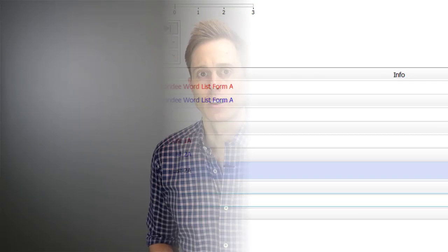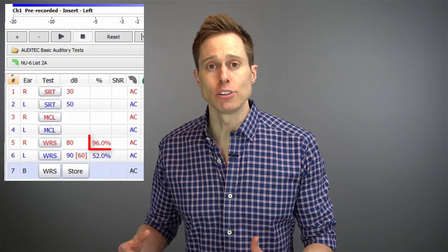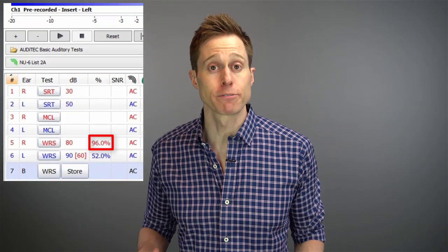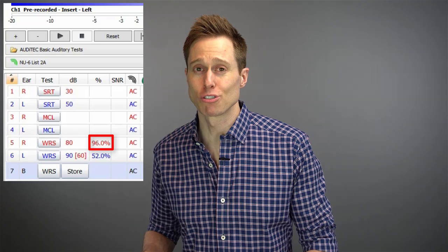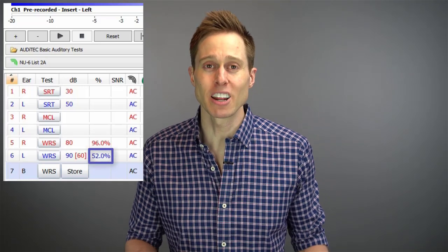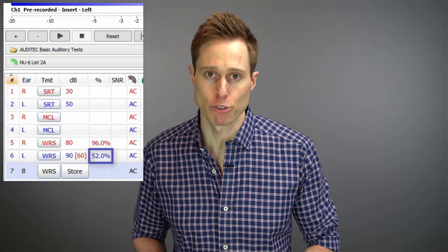The higher this percentage correct, the better off you are. These percentages indicate how well you should expect to hear speech in a quiet situation when you can't see the mouth of the person talking to you, and when you don't have access to context. If these percentages are really high, then you should expect to receive a lot of benefit from hearing treatment. If these percentages are really low, however, you should not expect to receive a lot of benefit from hearing treatment.